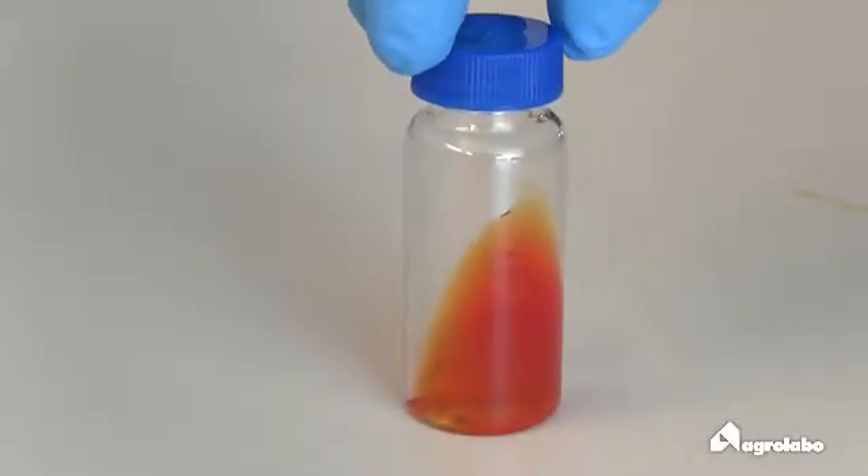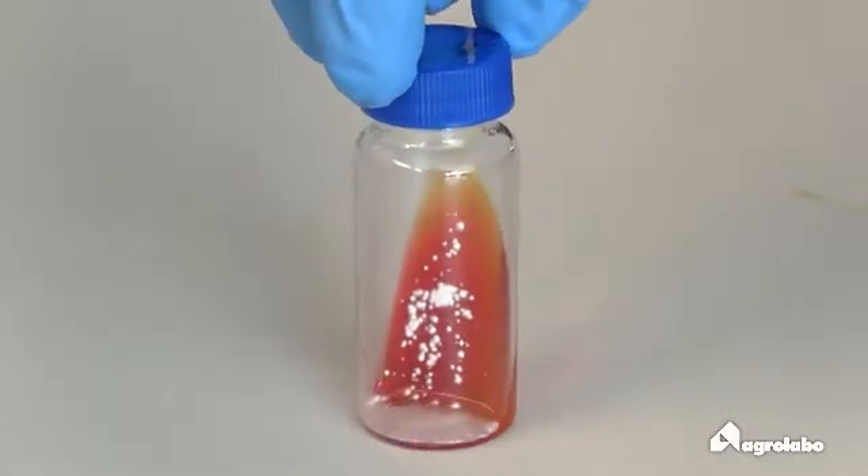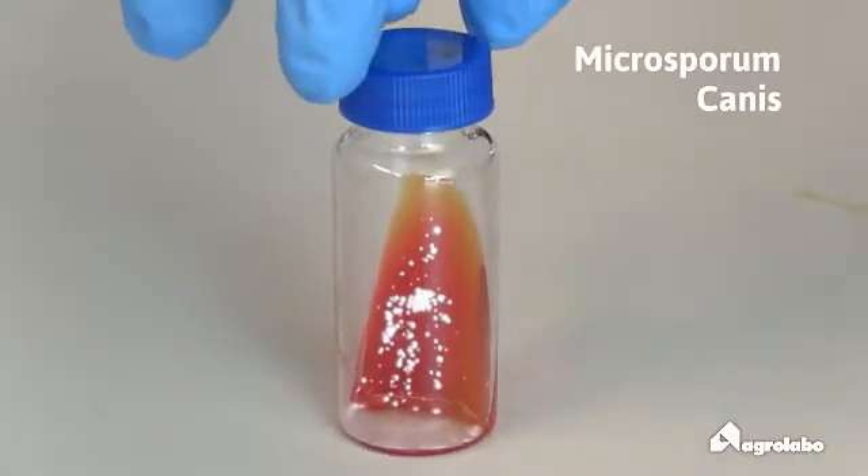The colony is cottony, white and yellow on the border. Reverse side: yellow then orange-brown.